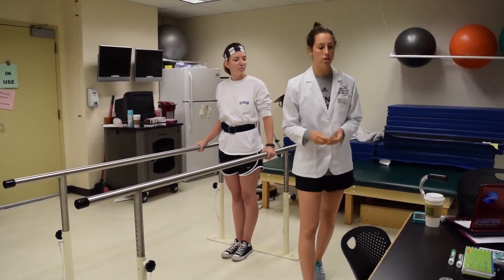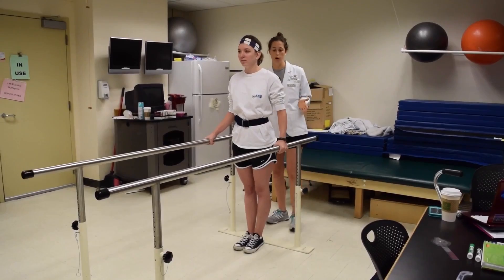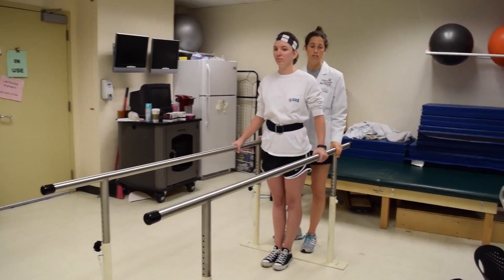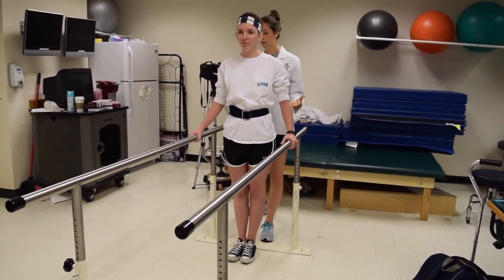We always want to make sure the patient is comfortable with where those bars are located. The third point we want to go over is the space between our patient's hips and the parallel bars themselves. You want to gauge somewhere between two to four inches of space for her to complete these gait patterns, which Courtney has as well. So on all fronts, we are good for fit of our parallel bars.